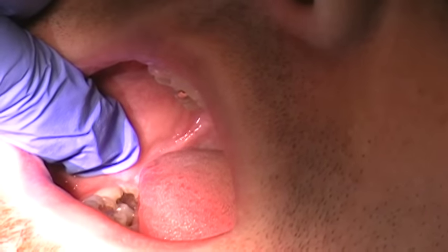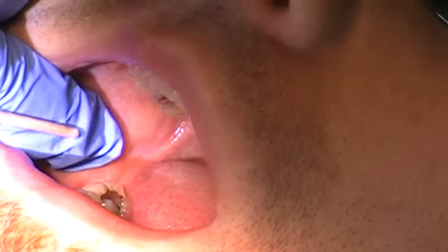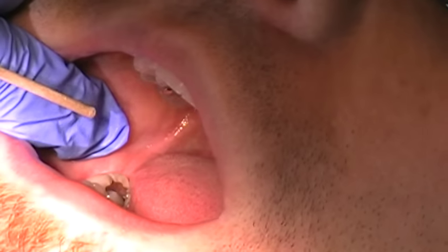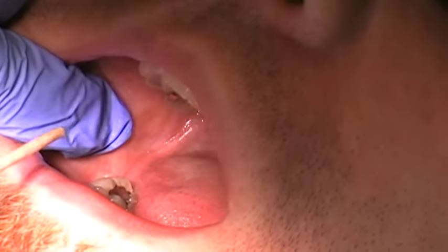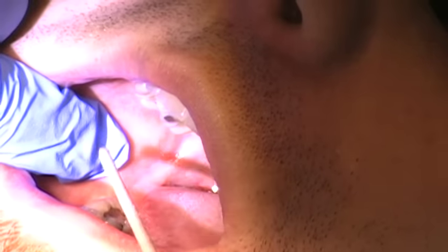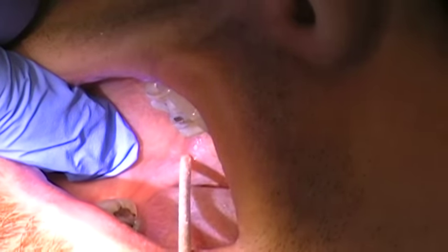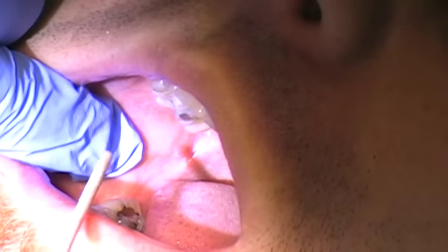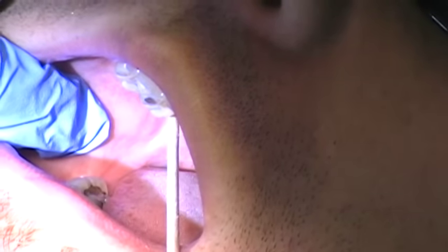The next thing I want to do is find the raphe — this is the pterygomandibular raphe. A lot of people use the coronoid notch to find their site, finding the deepest part and bisecting over to the site. For beginners though, I think it sometimes helps to just look at the raphe. It goes straight up and then it curves up towards the top, and the site is usually around the straight part right before it curves up towards the top.